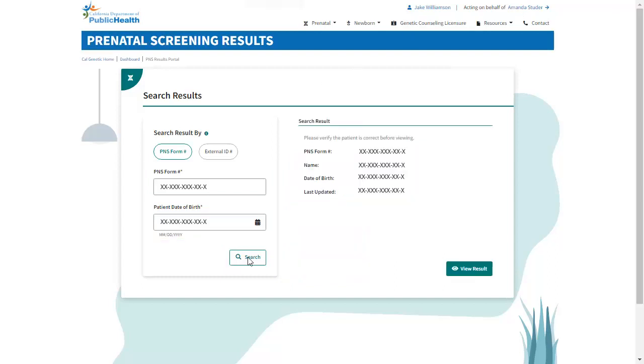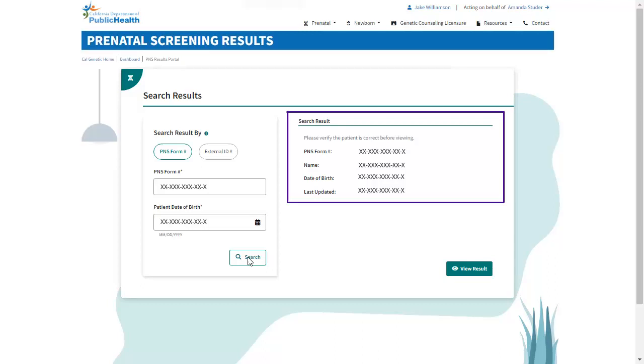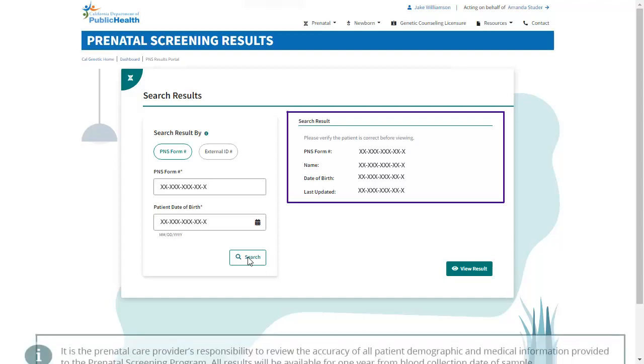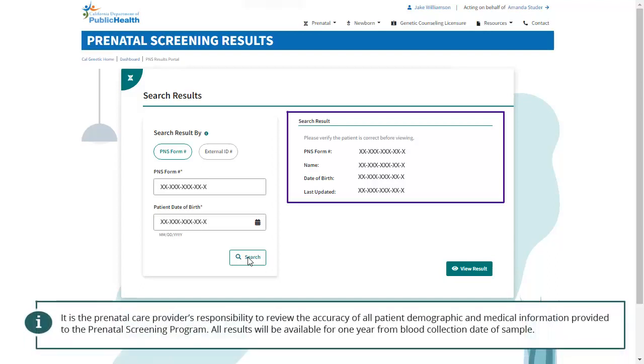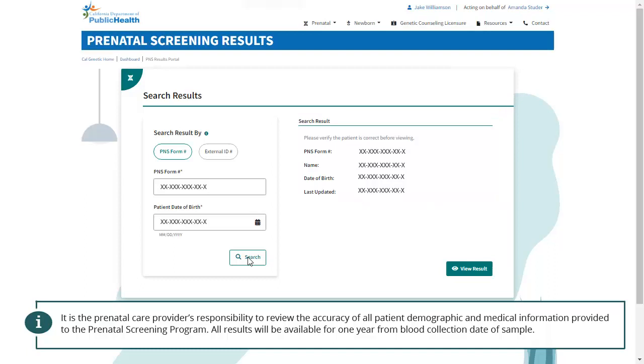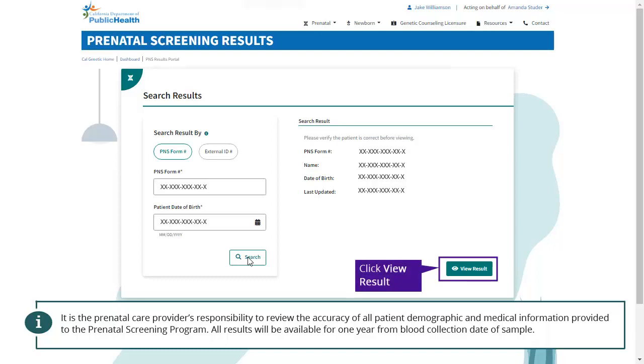If there are search results, you can view and review all patient case information. It is the prenatal care provider's responsibility to review the accuracy of all patient demographic and medical information provided to the Prenatal Screening Program. All results will be available for one year from blood collection date of sample. To view the result details, click View Result.